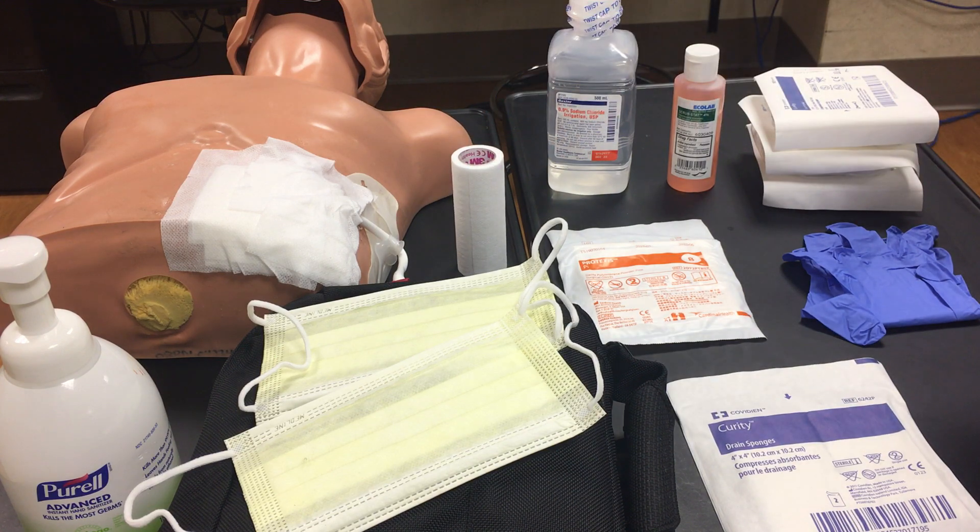The first thing you want to do is wash your hands or sanitize your hands. And you want to set up your equipment first.